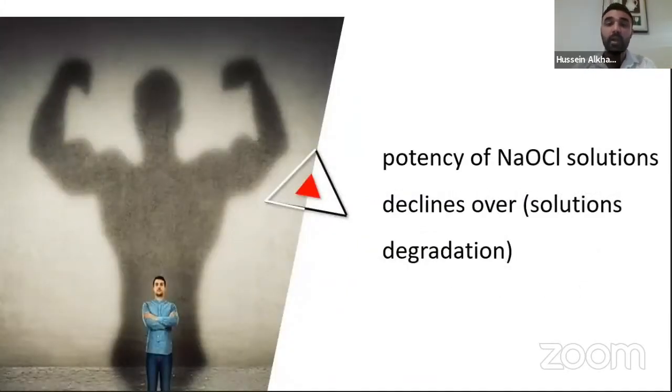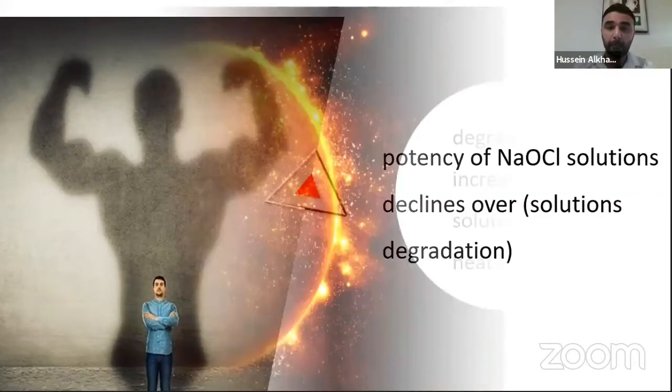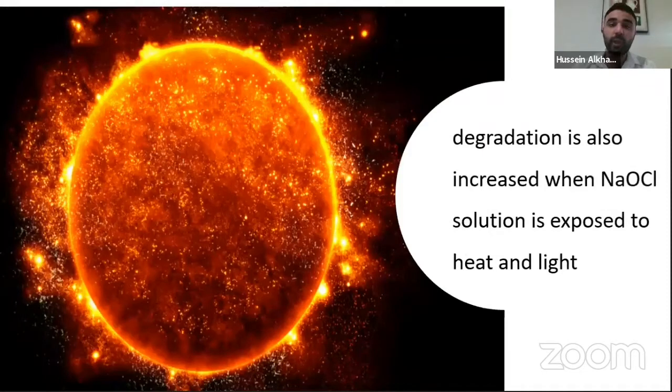Another limitation is, as we said before, the potency of sodium hypochlorite degrades over time as the particles start to degrade and interact with the dentine, so we should repeatedly and routinely refresh the sodium hypochlorite solution inside the root canal. Degradation is also increased when the solution is exposed to heat and light. So when we store sodium hypochlorite preparations, we should ensure that they are stored in dark containers away from high temperature in order to preserve activity.